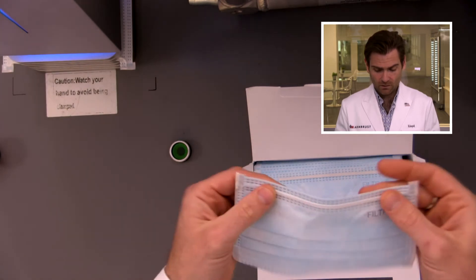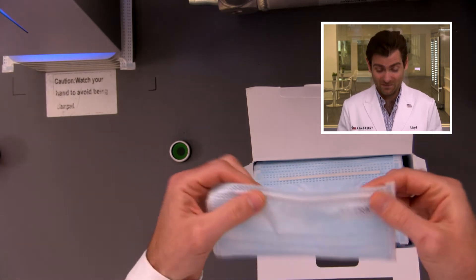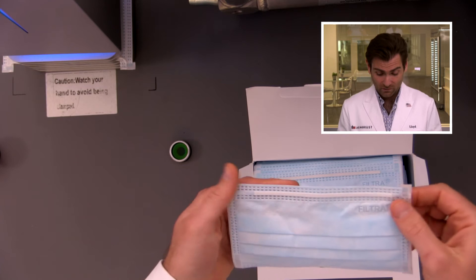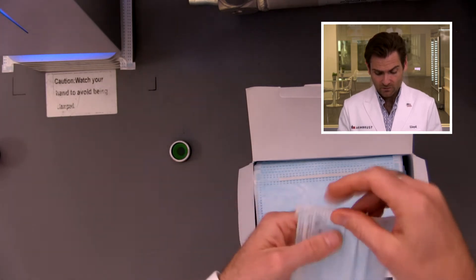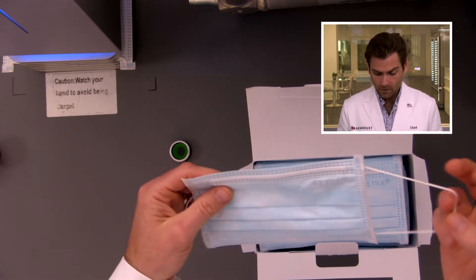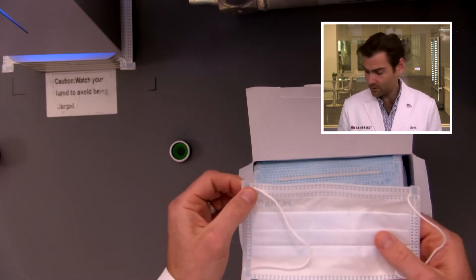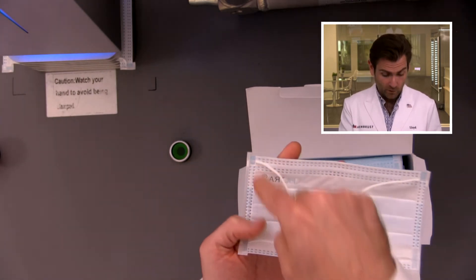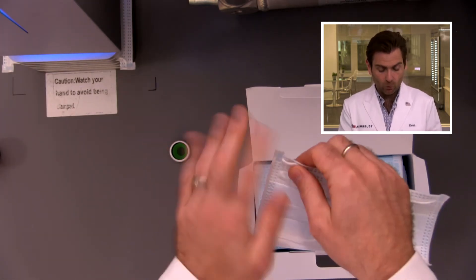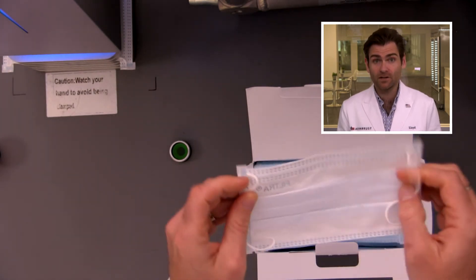The nose wire is a double nose wire — we use the same one, very awesome. It's great quality and they're doing almost a full tangle, going almost all the way across. That's a really good product. They're using a design developed in Taiwan, which means the ear loops are probably pretty awesome because instead of just point welding them, they're folding over the end and welding it, which is going to make for a pretty strong ear loop.